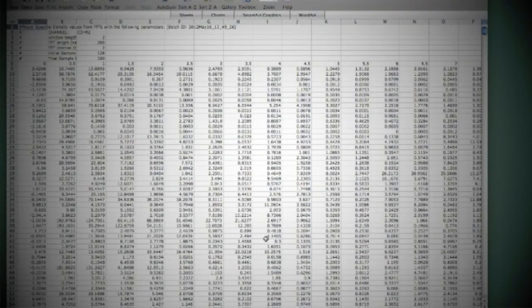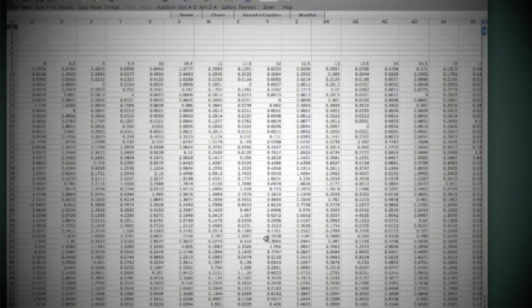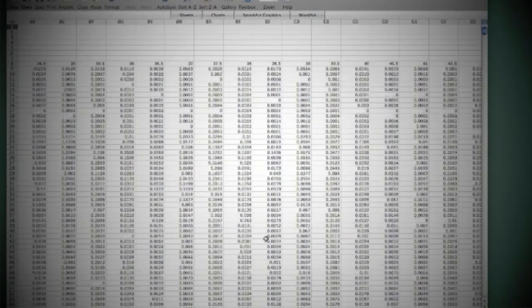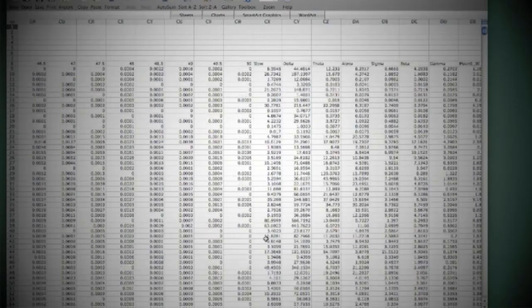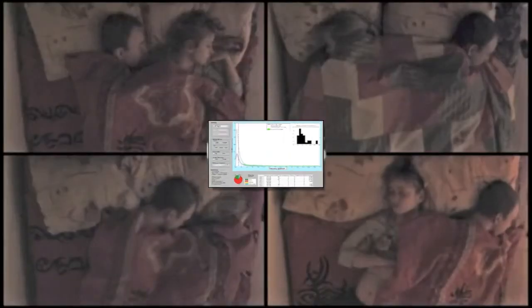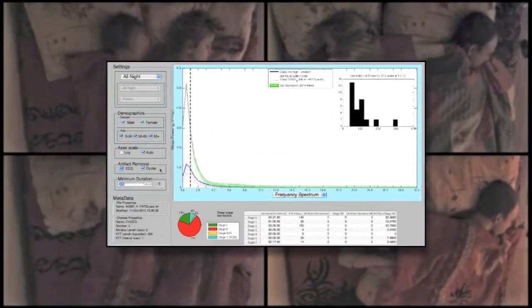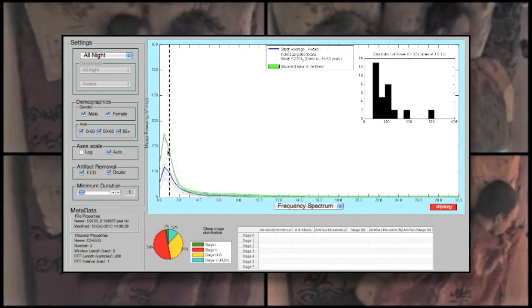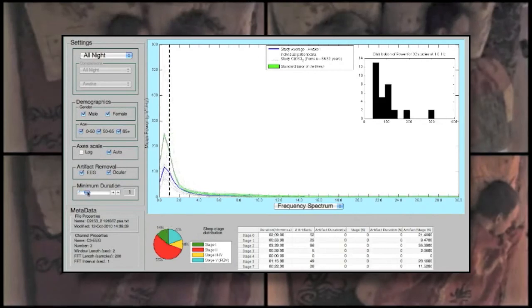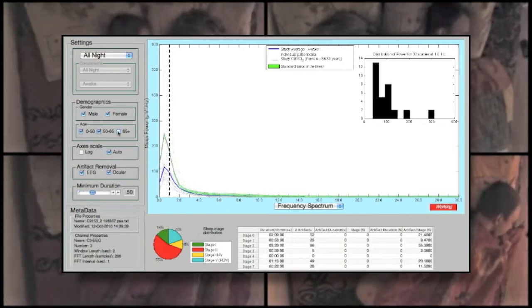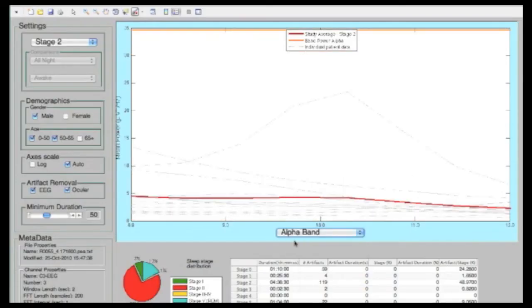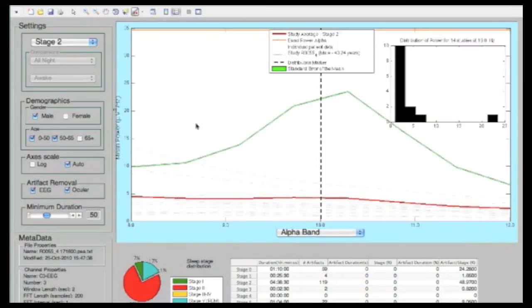Post-processing SEV output may be accomplished using any statistical package or software custom-built for a particular aim. The PhenoFinder, shown here, is one such tool, developed specifically to examine power spectral output from the SEV according to sleep stage and demographic.